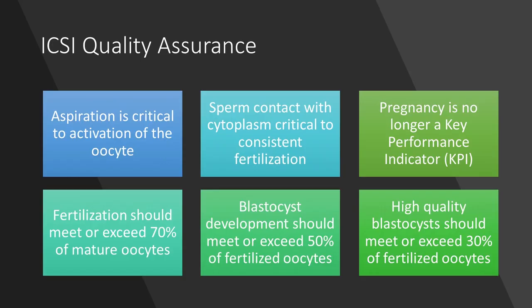And make sure that you're doing consistently your ICSI every time, and then make small adjustments as you go forward. It is critical that the sperm comes in contact with the cytoplasm. In the early days of ICSI, we had large needles and injected too much PVP and had lower FERT rates because the sperm would not be in contact with the cytoplasm. Through this learning process, you don't have to learn that.